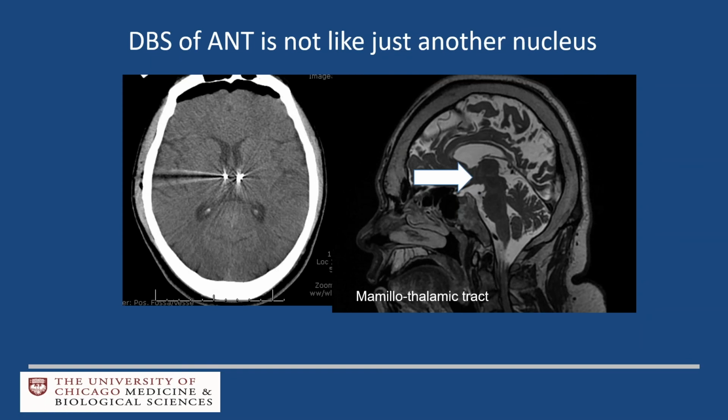So that brings us to the next topic. This is still epilepsy, but it is DBS, and this is very critical, where I would never do this without intraop CT. This is an anterior nucleus of thalamus depth electrode implantation for epilepsy treatment. As you know, the original trial, the SANTE trial, because you have to use a transventricular access, showed that about 10% of the electrodes, because they are not that rigid, deviate from the target, which is excessively small due to going through the ependyma twice.